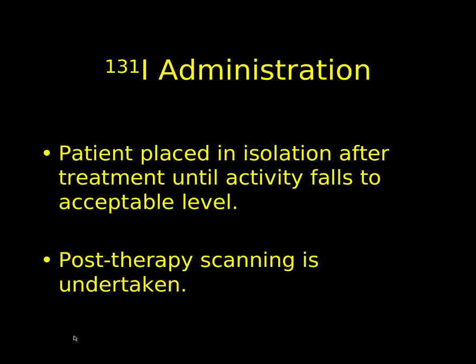It is possible to treat the patients as outpatients, and some institutions do this, but you need to make sure the patient is very careful that they don't contaminate other people if that's the case. Once the activity has fallen to a certain level, they can undergo post-therapy scanning, and then they can be discharged. But it's very important we have that post-therapy scanning before the patient leaves the hospital for all the reasons I've described.